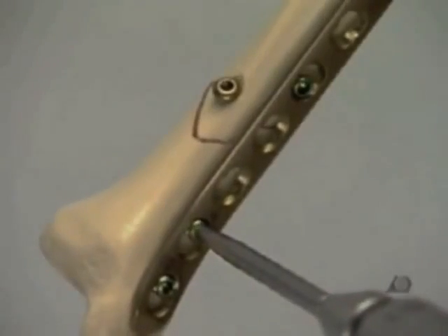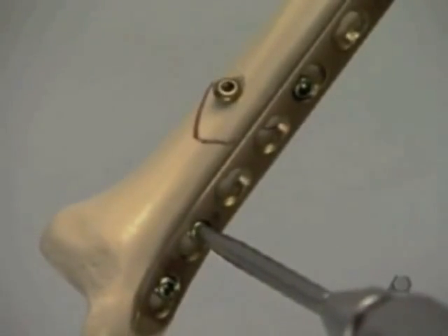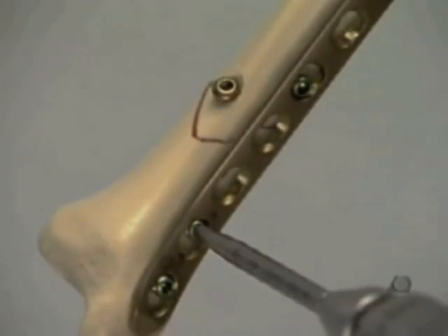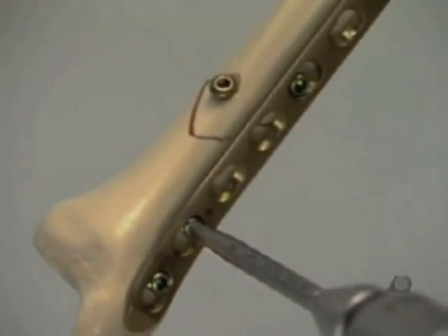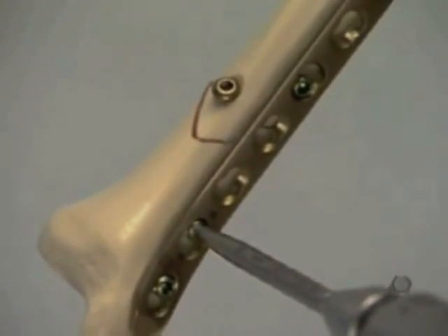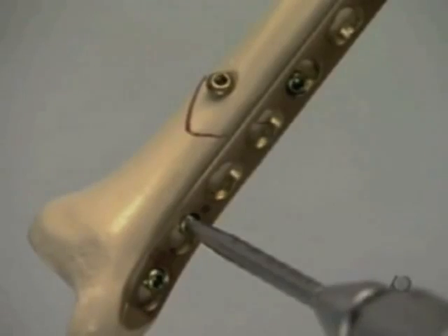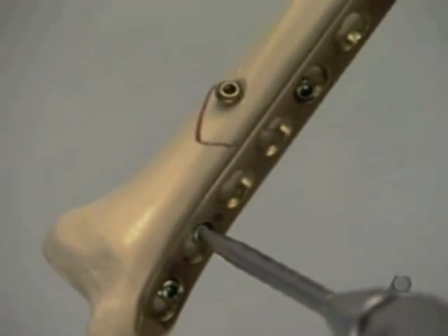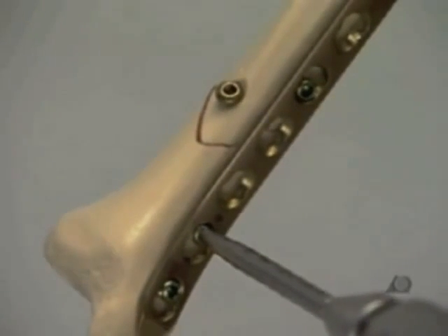To finish the fixation, one more locking head screw is introduced in the distal main fragment.